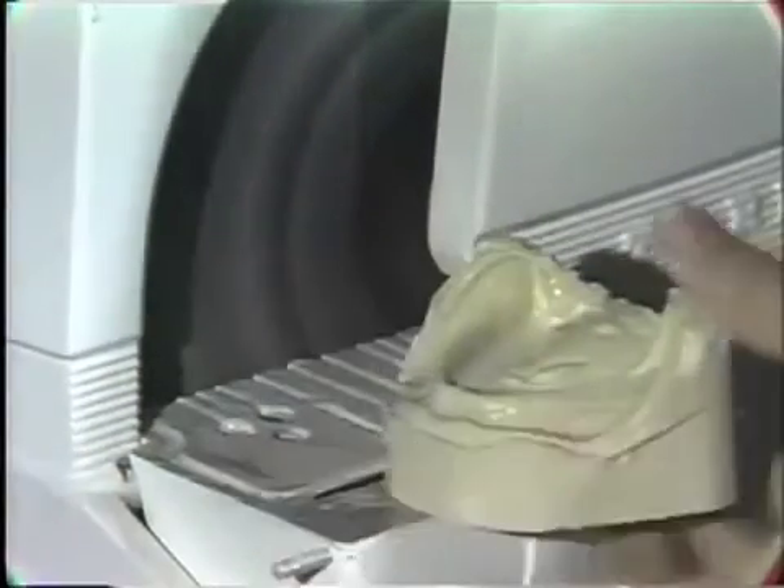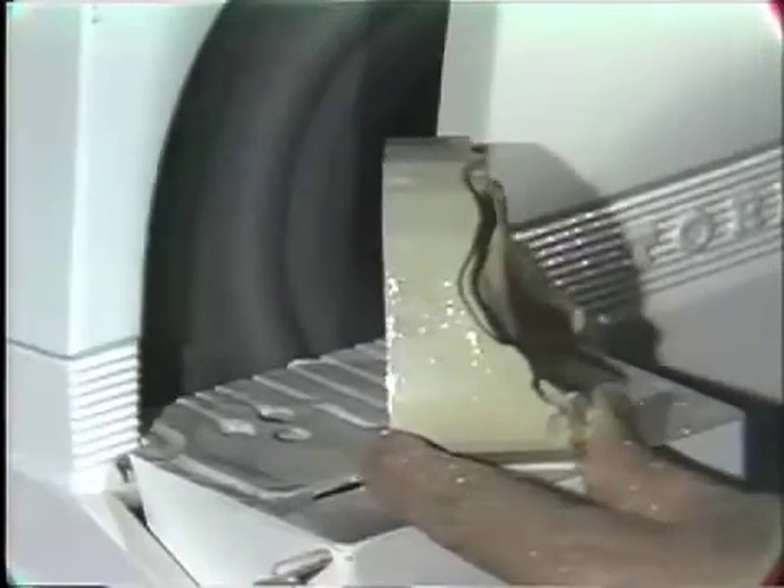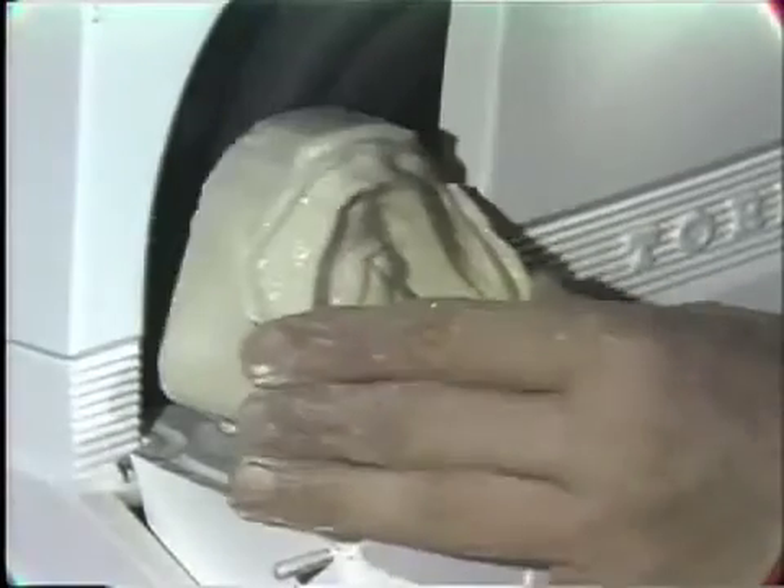Do you want to look at the other side? Similarly, one should inspect the base thickness of this model. Again, you can see it is quite thick and it should be reduced.